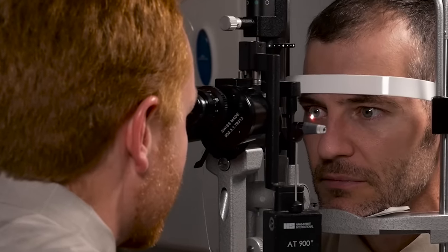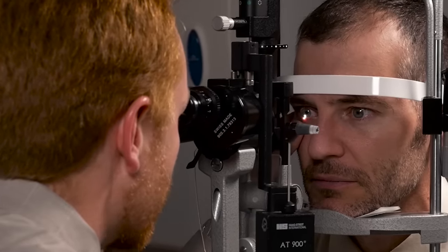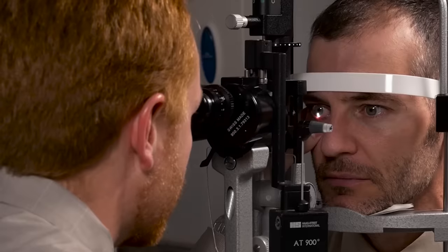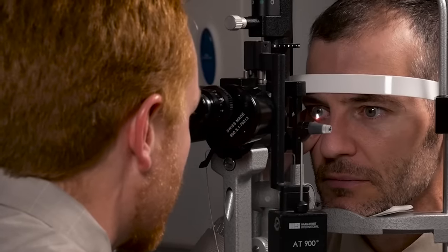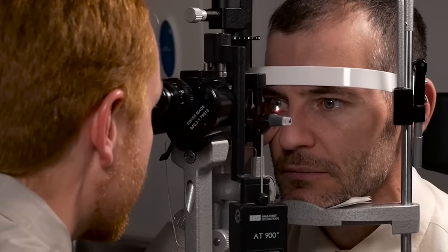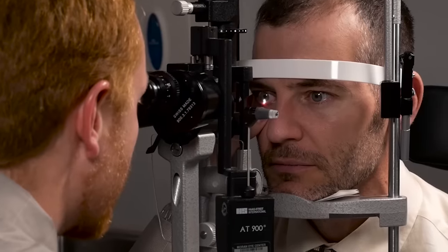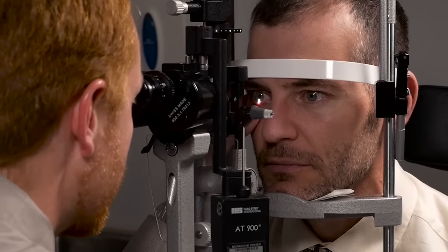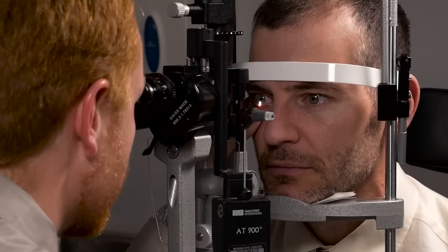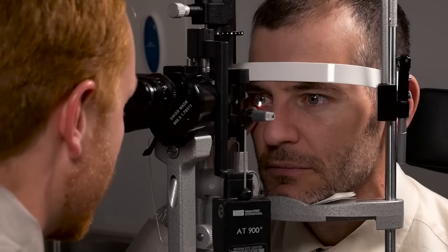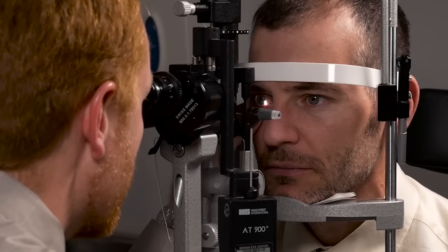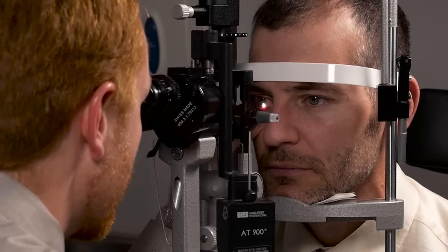Now there are several factors when assessing a contact lens. Number one, what we can do is we can pull down on the lower lid just gently and we can see the toric marking. In this particular brand of contact lens, the toric marking should be ideally at six o'clock. As you can see here, the contact lens is about 10 degrees to the left, so it's rotating a little bit temporally. As you assess this, have the patient blink normally. And as he blinks, you can see the movement of the contact lens.